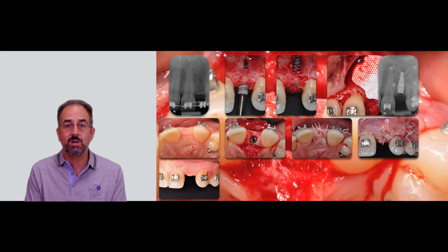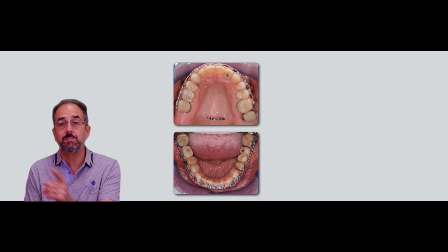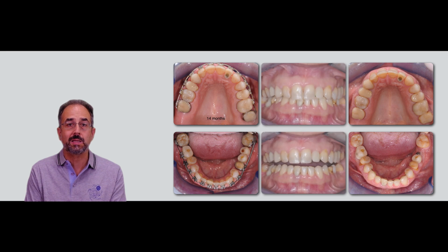So we totally covered the implant, and after about 6 months, actually longer than 6 months, because she had moved to Paris in the meantime, it took us about 12 months before we were able to uncover it. And here's the situation with the implant supported provisional in the position of the upper left lateral incisor. And soon after this slide, we removed the appliance, and this is the situation as she was debanded.